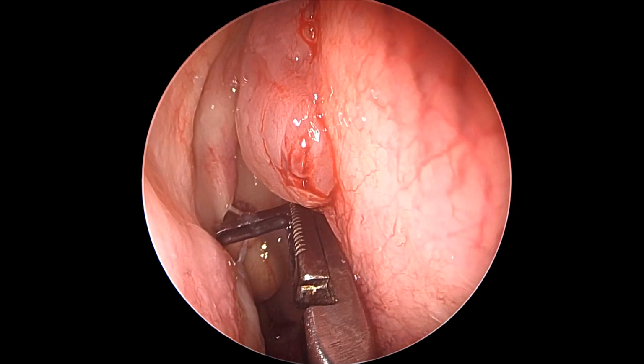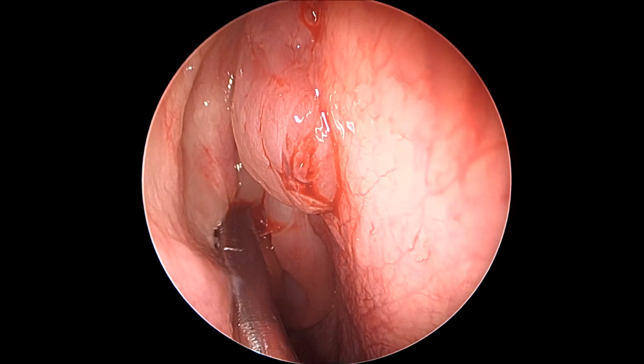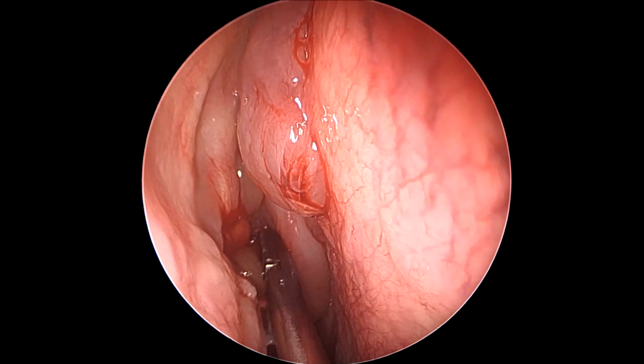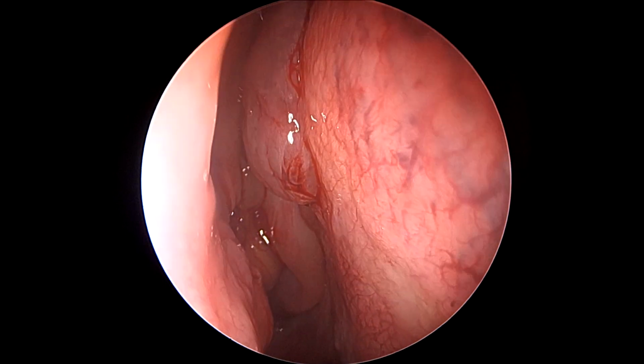You begin from the right side with an uncinectomy. This is a standard procedure. We use the standard backbiter for doing the uncinectomy. This is a much safer way than using a sickle knife, which has the potential to penetrate the orbit.